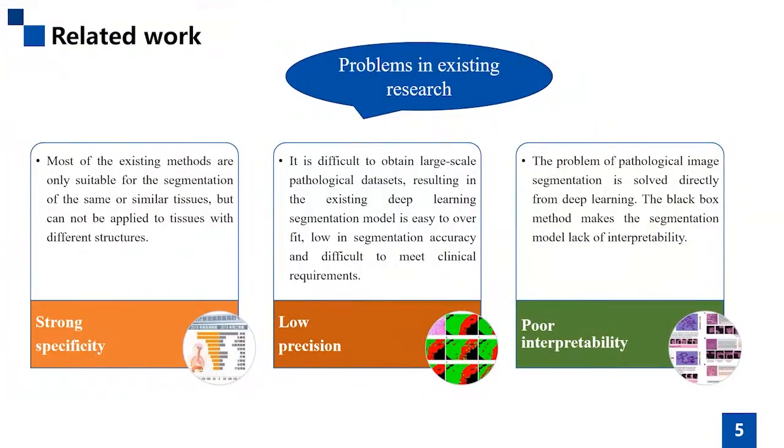It can be learned from literature research that dataset, segmentation accuracy, and model portability are still the difficulties in tissue segmentation. In addition, most deep learning methods lack explainability and have no acceptance in the medical industry.